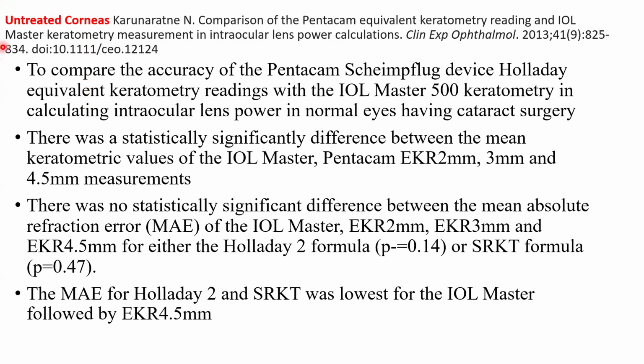Another study was conducted in untreated corneas. The aim of the study was to compare the accuracy of Pentacam Holladay EKR readings with the IOL Master 500 keratometry in calculating IOL power in normal eyes having cataract surgery. They found that there was a statistically significant difference between the mean K values of IOL Master, Pentacam EKR 3 and 4.5 mm, but there was no statistically significant difference between the mean absolute refraction error of the IOL Master and the EKR 3 and 4.5 mm for either the Holladay 2 formula or the SRK/T formula.